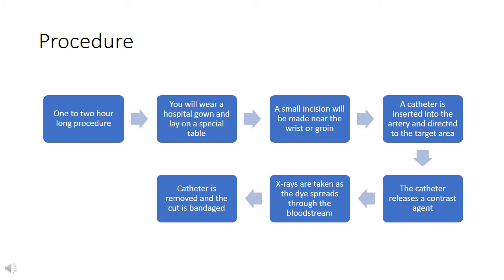X-rays are taken as the dye spreads throughout the bloodstream. And finally, the catheter is removed. Don't worry, the cut is small enough that stitches are not needed.